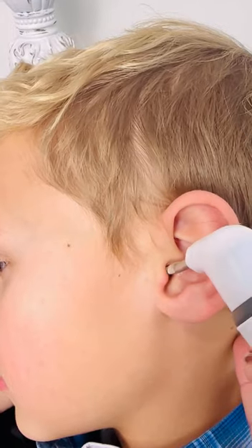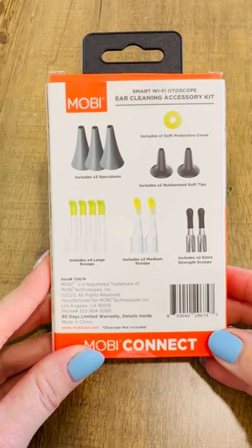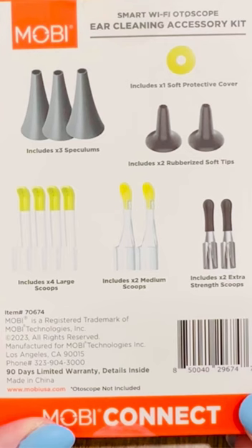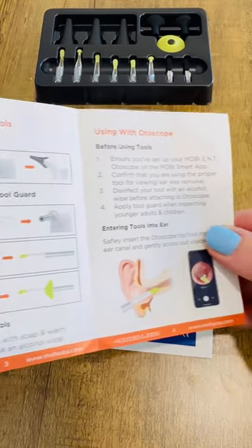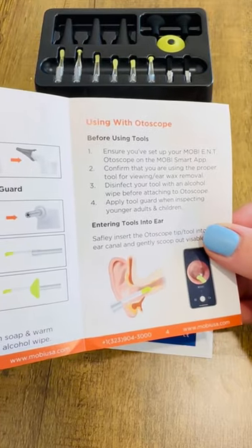You can choose from 14 different reusable Pro-Grade tools. It includes 3 speculums, 1 soft protective cover, 2 rubbery soft tips, 4 large scoops, 2 medium scoops, and 2 extra strength scoops.